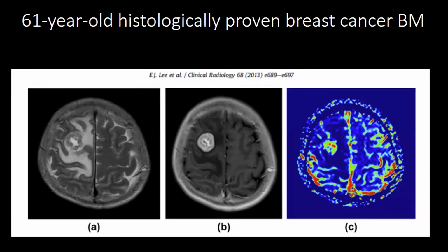metastases. The A panel is a T2 imaging without the suppression of fluid, and you can see that there is FLAIR hyperintense, there is T2 hyperintensity surrounding the lesion, which is heterogeneous in nature with the hypointensity reflective of the increased cellularity. The middle image is the post-contrast image demonstrating enhancement, and the last one is the rCBV DSC, which shows that you have corresponding increase in blood supply, because the ones which don't have blood supply are very blue and sad looking.